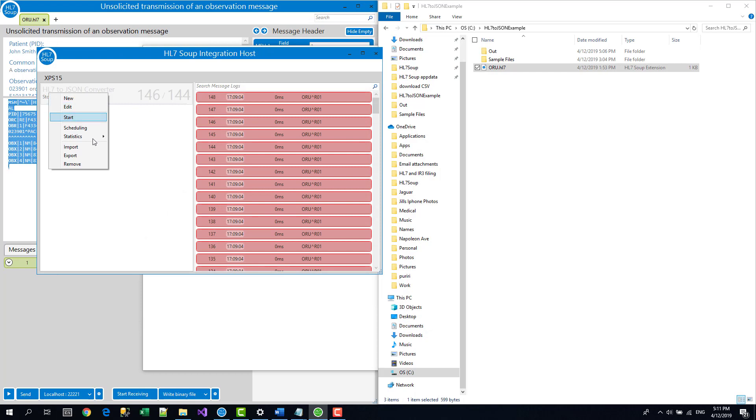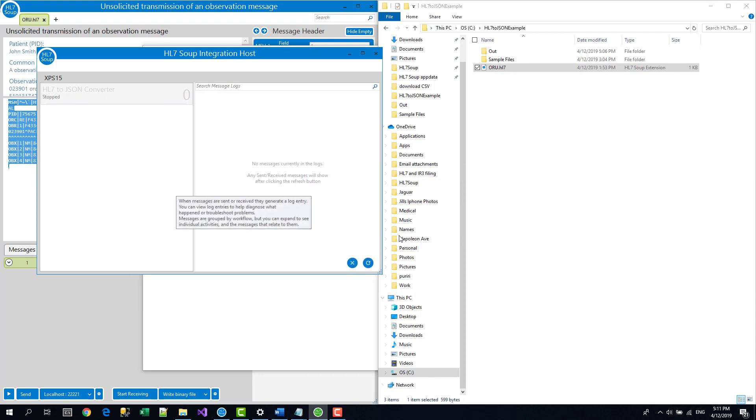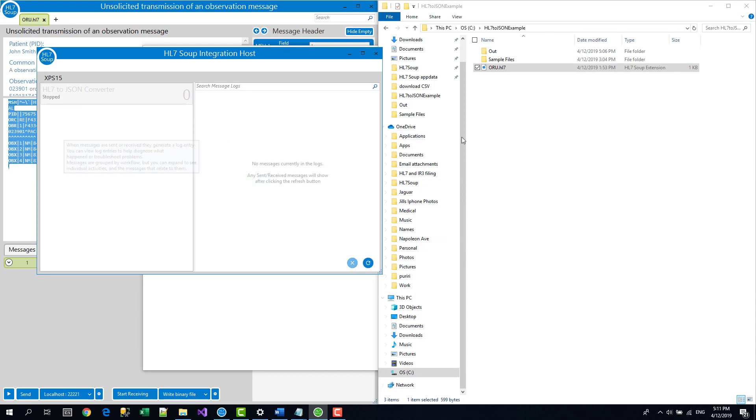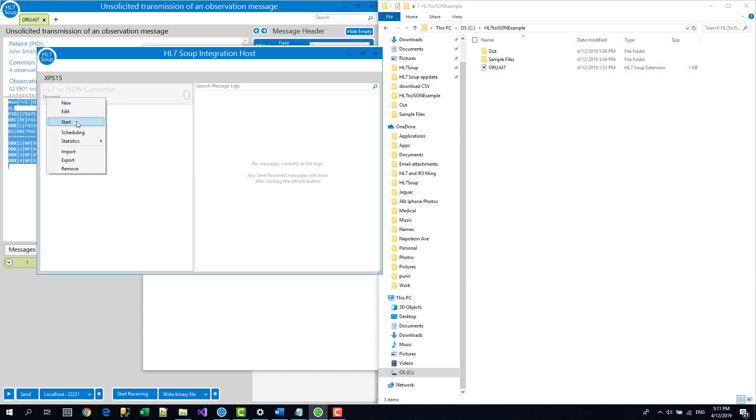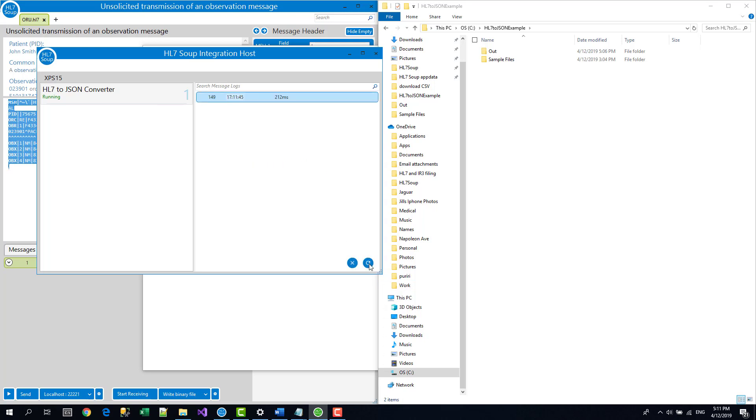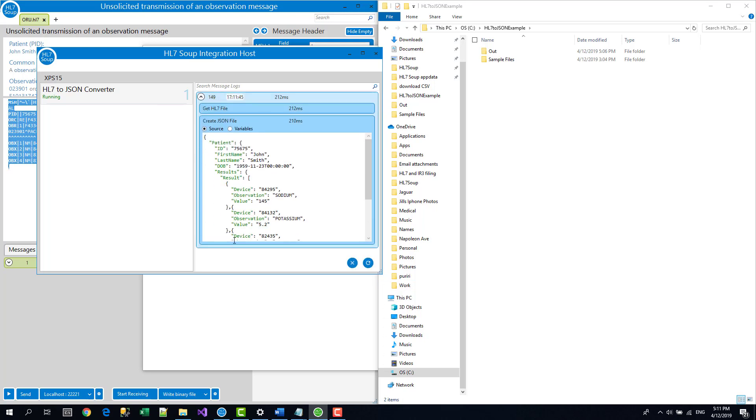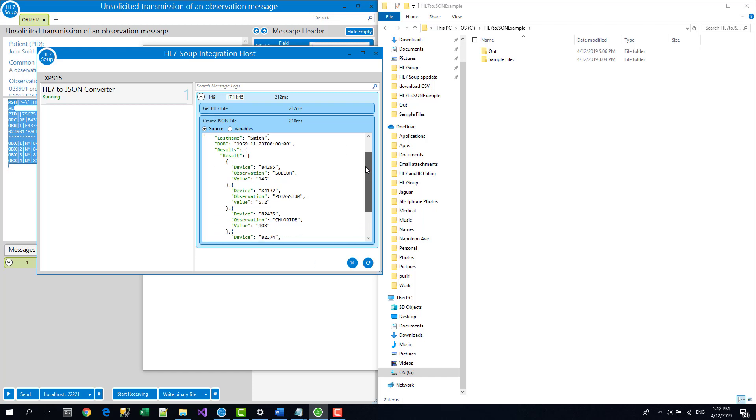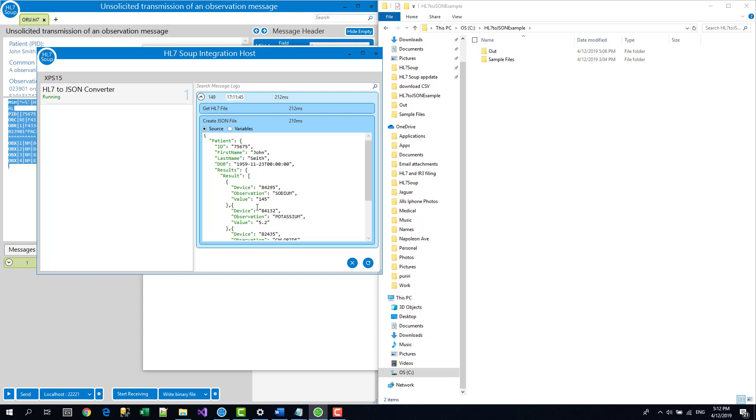I don't want all this junk, so I'm just going to clear out all the statistics. Okay, no messages here. No errors showing. I can just start it up. And it's processed. And we've had one success. So I'm just going to refresh the logs and have a look. And here is our created JSON file. And it has created the four values. So it's not just the three that the sample message had and it's populated all the fields correctly and we've got all the other values. So that's worked really well. So that's got the entire conversion going.